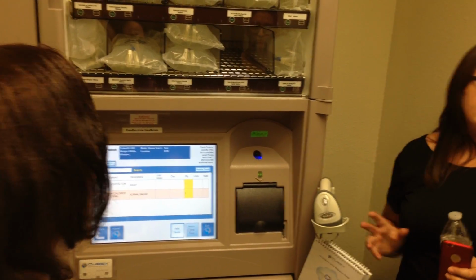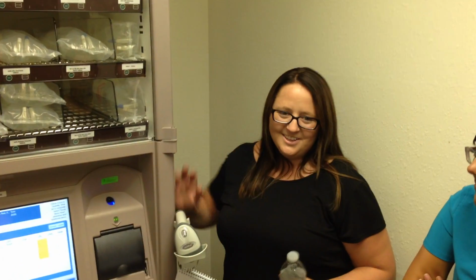I was doing a lot of things at one time while we were in there, so he should have said that any non-control supply items, you can grab without calling the pharmacy. Okay, that's what I was asking him. Yeah, for non-control. For controls, you have to call the pharmacy if it's not there. If it's already there, we have a valid order, so you can go ahead and grab it. If it's not there, call the pharmacy.